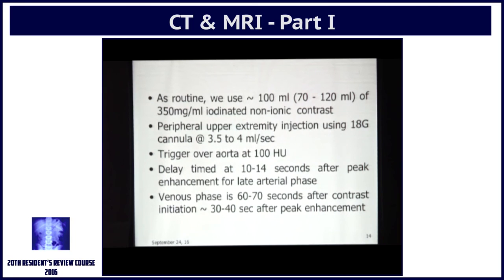You have to use the late arterial phase because you have to give both the liver and the lesion an opportunity to pick up the contrast. If you don't give the normal parenchyma the opportunity to pick up contrast, you will not get parenchymal attenuation difference between normal and abnormal parts of the liver. So this is probably the most valuable tip that I'll give you all afternoon. The delay in a case of CT for liver in the arterial phase has to be between 10 to 14 seconds.